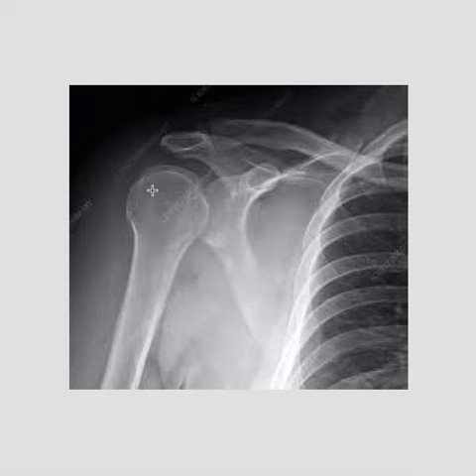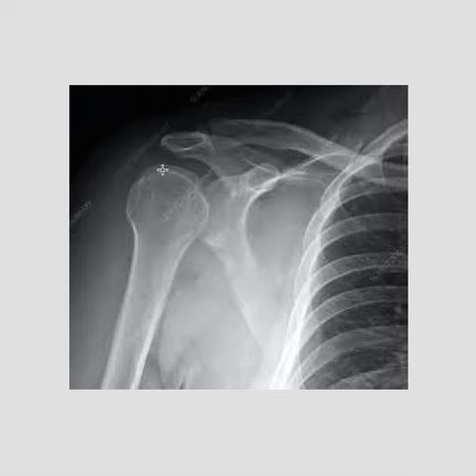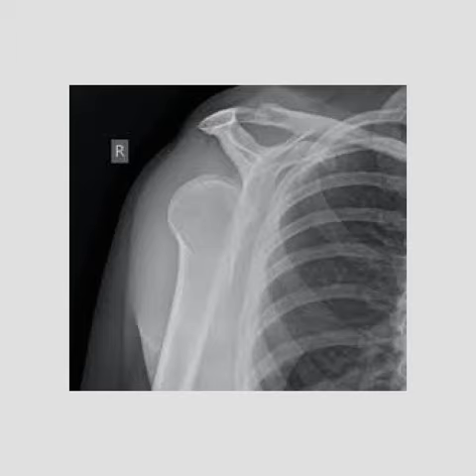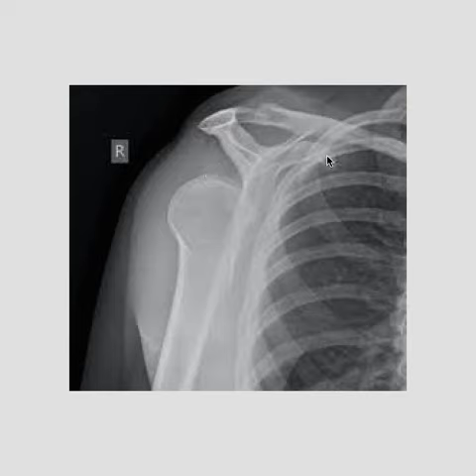If the radiologist does not pick this up, the patient won't be able to move their shoulder in a certain way and will have persistent pain. It is up to you to catch this, because late posterior dislocations that are picked up late and not reduced have very, very bad outcomes. This symmetry of the proximal humerus is called the light bulb sign because it looks like a light bulb. If you see this, be very, very suspicious for a dislocation. In those cases, you obviously want some other view. Here is a lateral scapular Y view, and even here it doesn't look completely abnormal. But if you extrapolate this Y — here's the top part, here's the bottom — the glenoid is supposed to be right here. And the humeral head is not there where it's supposed to be. It's in the back, because this is the coracoid and that's the acromion — so this is posterior. That's very, very suspicious.